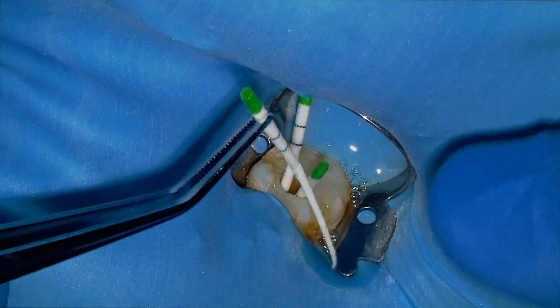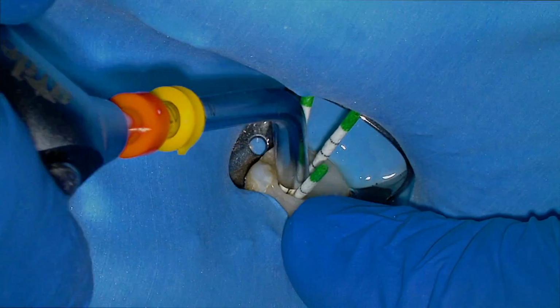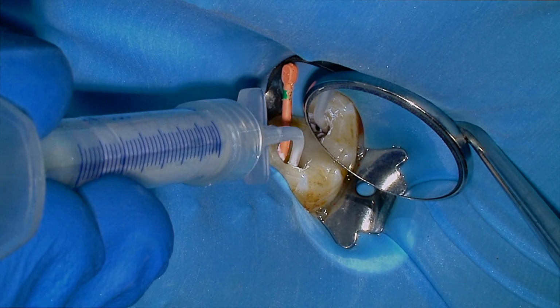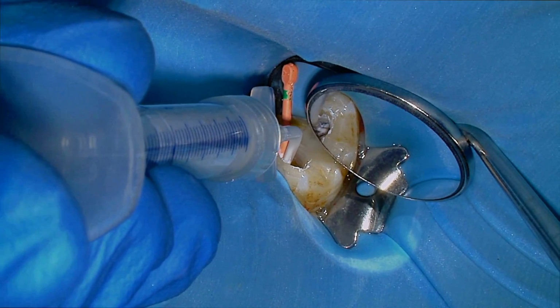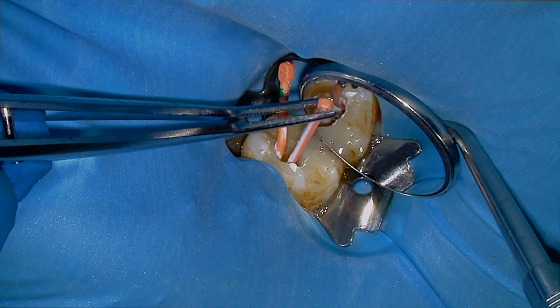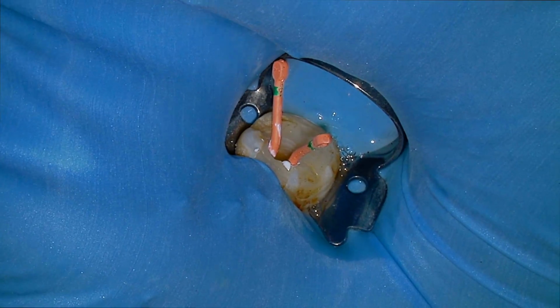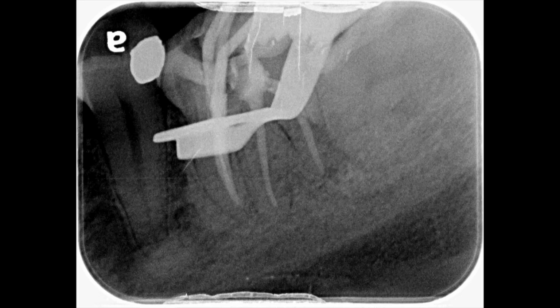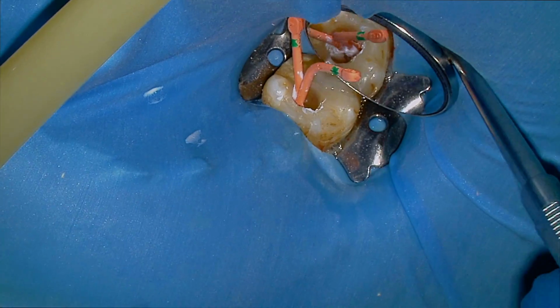One of the tips I was taught was to place all your paper points and then blow some air, and that wicks up some of the moisture. We're going to place our BC Sealer, and then we're going to take a working length radiograph. So I'm happy with the radiograph.